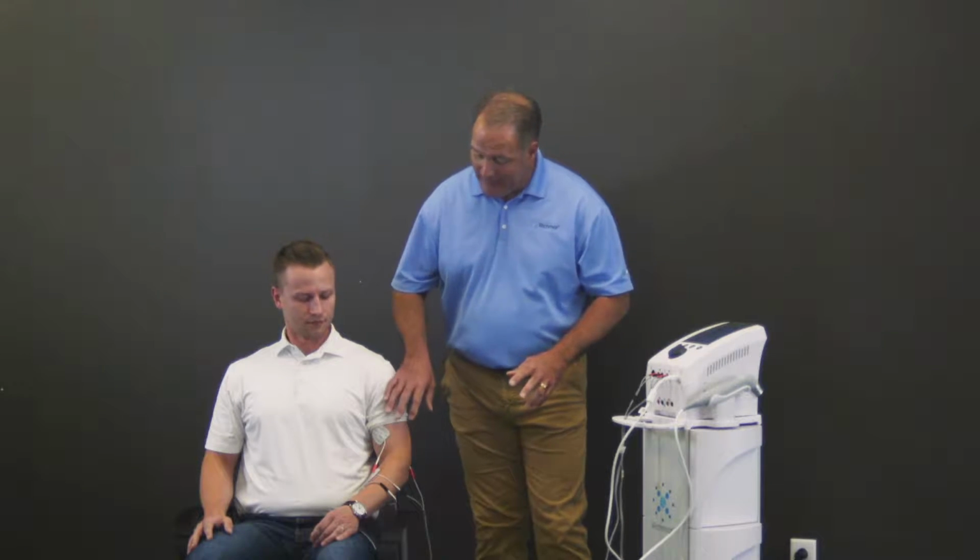The one thing that everybody forgets about interferential is that, because of the type of waveform, it has a lot of current and packs a lot of power. You also have to remember that part of this protocol is the nerve block portion. So if the patient goes numb and does not feel the stim, what a lot of clinicians want to do is keep turning up the device to get more power because the patient has lost sensation. When they lose sensation with this protocol, it's just telling you it's working. So don't continue to increase the power. Just let it go and finish the treatment.